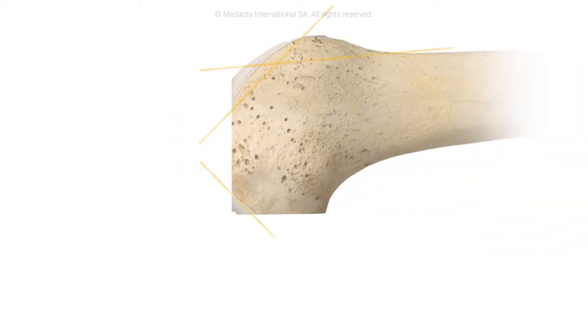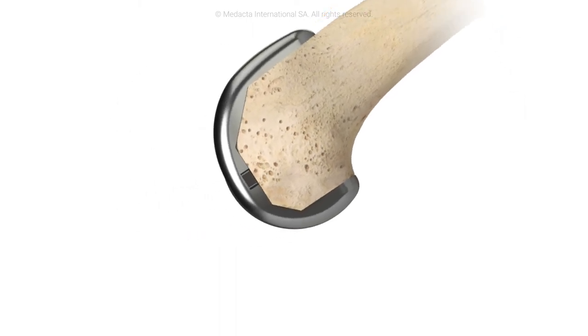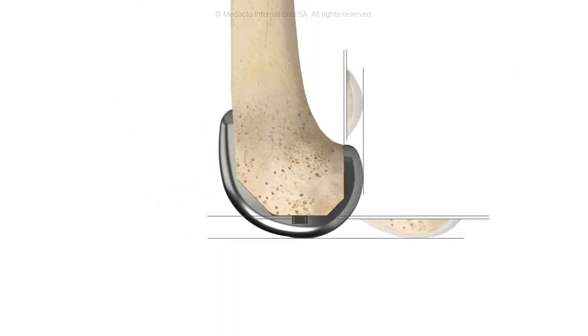Once femoral preparation is completed and the implant is positioned on the bone, the native femoral articular surface is restored.